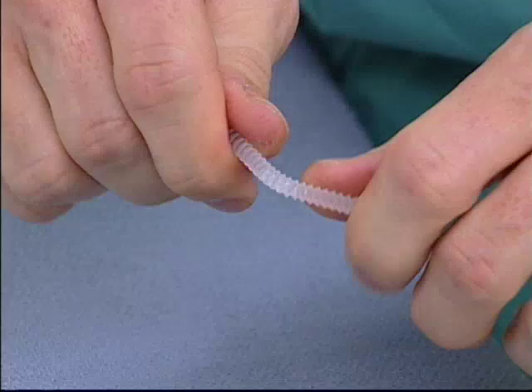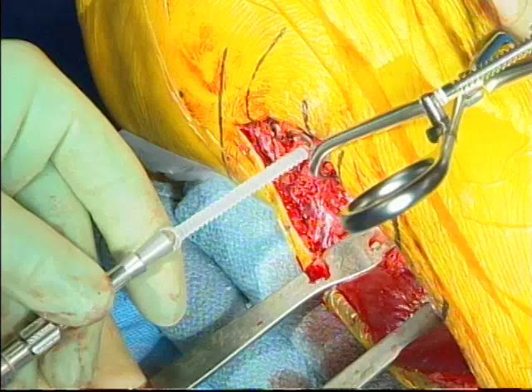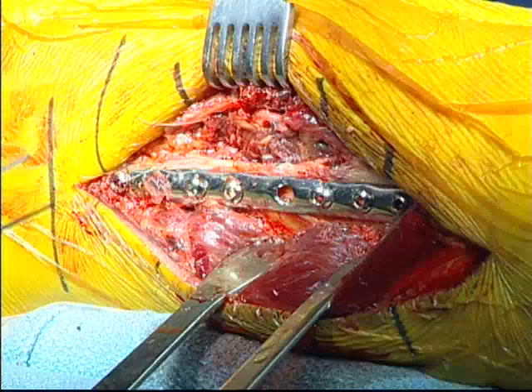Biomechanically, not only is it weaker, but it does not necessarily afford any intrafragmentary compression. We've used polyglycolic acid screws in the past. They tend to have a higher rate of inflammatory reactions, irritation of the soft tissue, and collection of the drained byproduct. So I think they're not as good a choice as the polylactic acid screws.